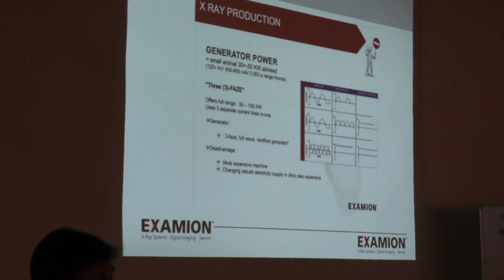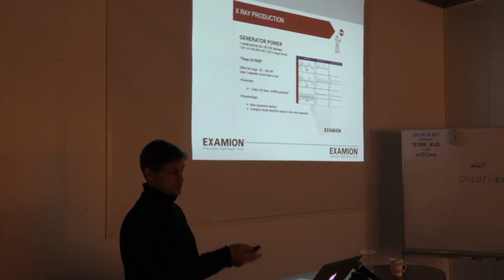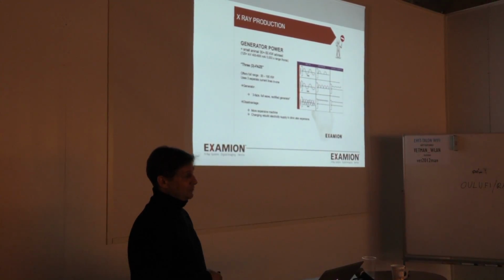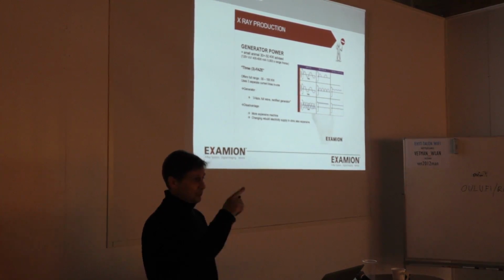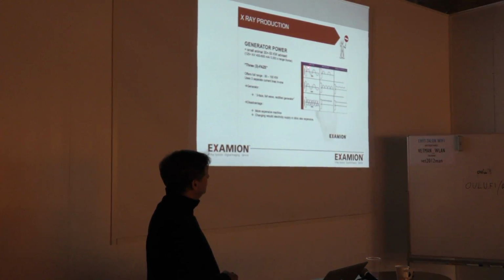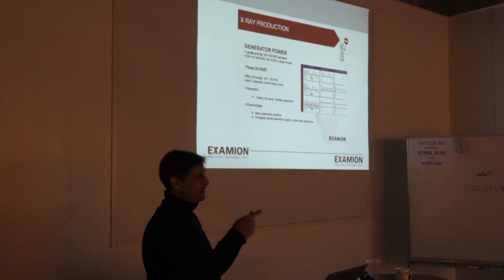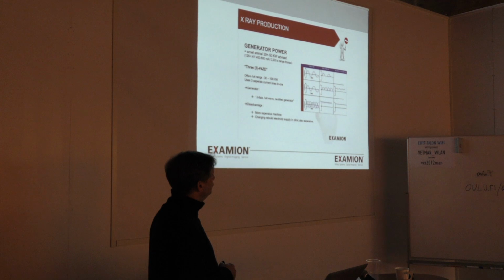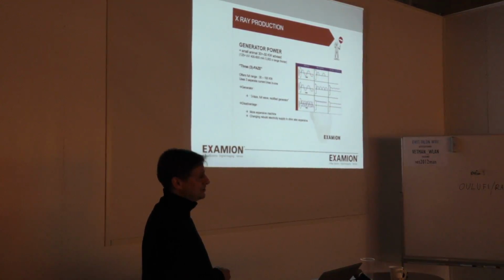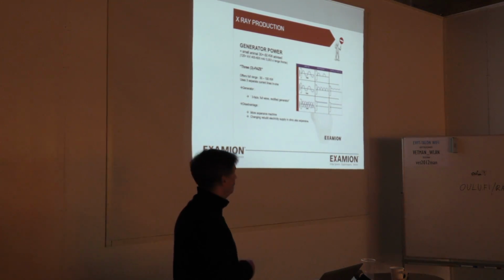Now, in the past we used three-phase electricity for that. That means if you had a machine, you needed to have very large power in it, and an adaptation. As you know, in the socket you have 220 volt and it's monophase, so that means you have an oscillation in there. This is the oscillation. In X-ray we can only use the tops, the maximum of the power, so it's only two small moments within one cycle that you can use to produce X-rays. And the negative side is actually dangerous, so we rectify that, we take that away. And in three-phase, what you do is you build up more oscillations, so three times as many. With three times as many, you can also produce much more power.